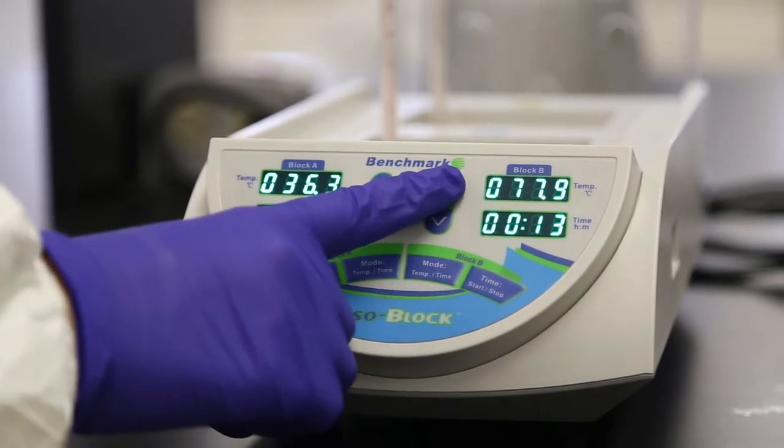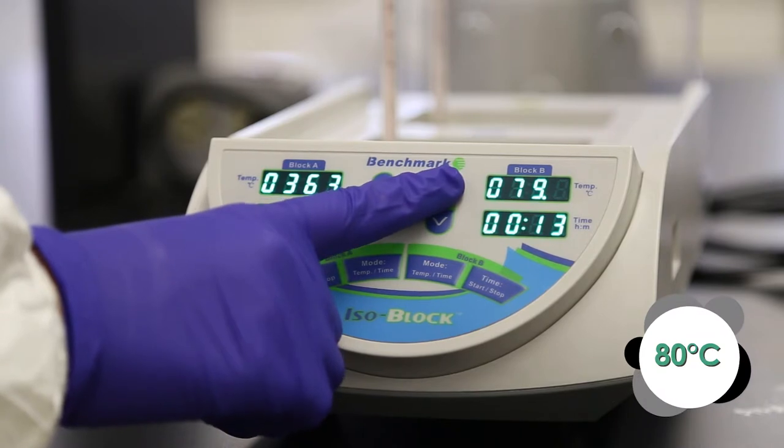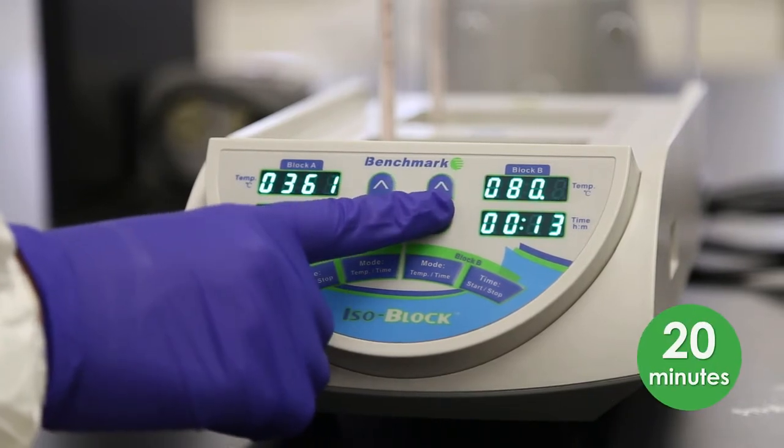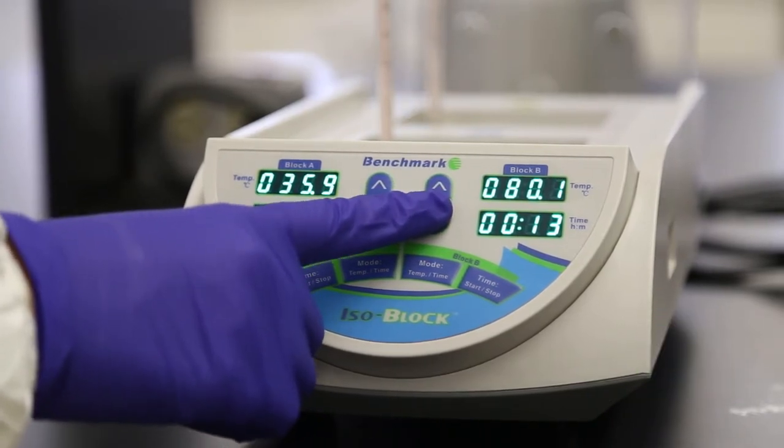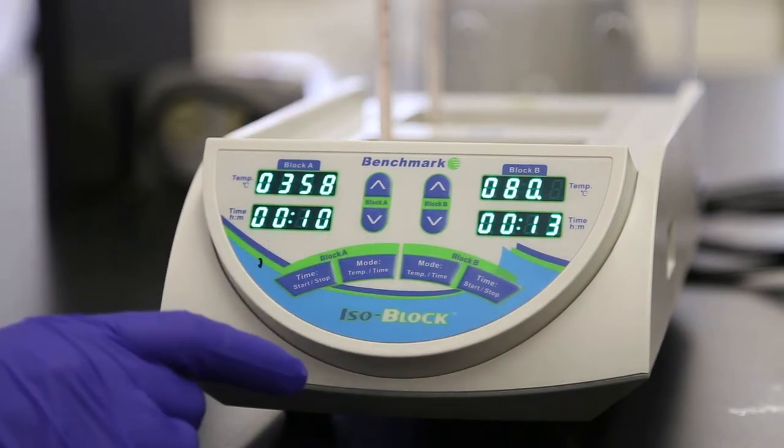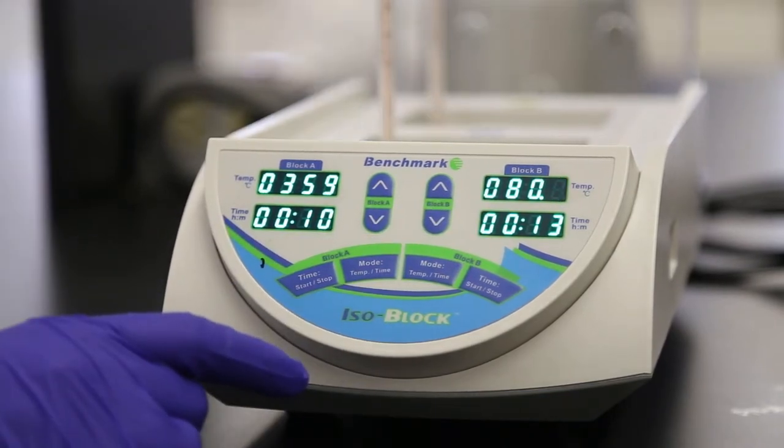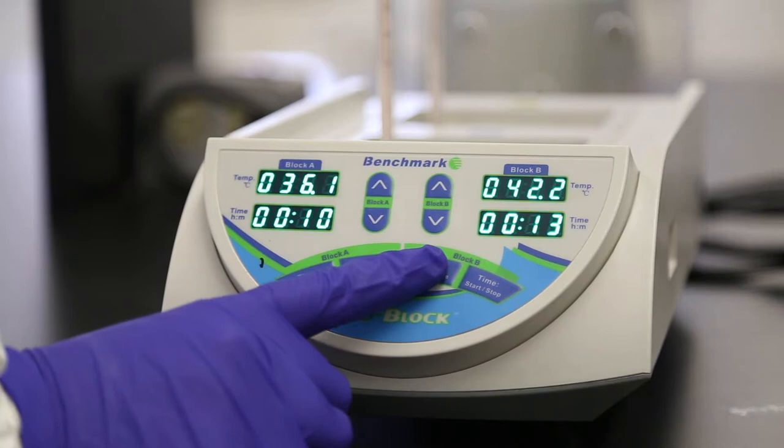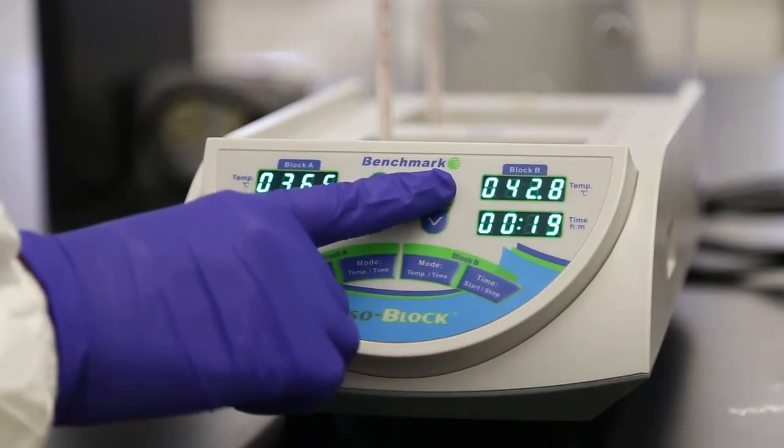Next, set the temperature for Block B to 80 degrees Celsius and the timer for 20 minutes using the controls for Block B following the same steps you used for Block A. Again, the block will immediately start heating. Do not start this timer either.